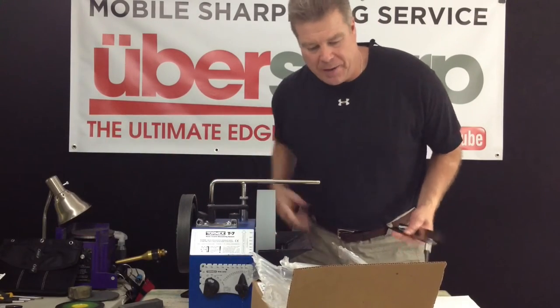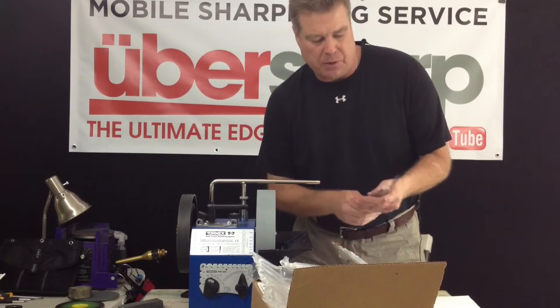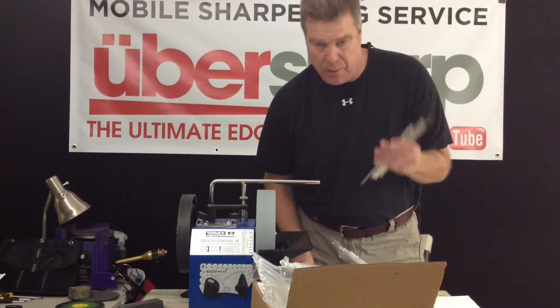Hi, welcome back to Ubersharp. Today I'm shipping off some surgical bone chisels that I've just sharpened.